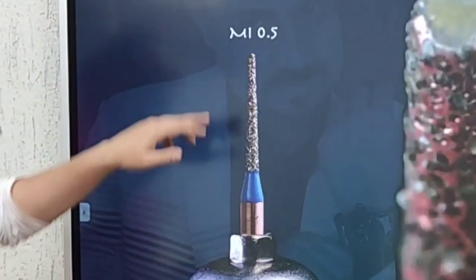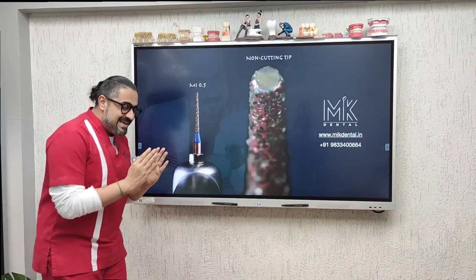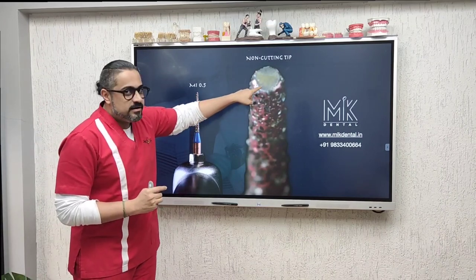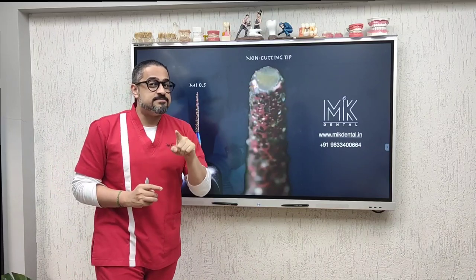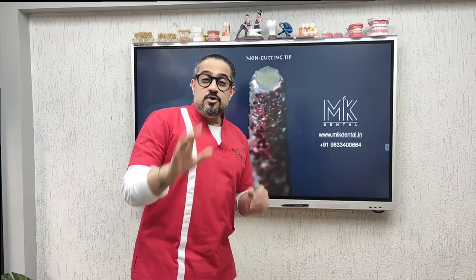To prevent this, friends, I have taken the next step and designed something called the MI 0.5. This is a modified interdental burr — it's a thin taper burr. Look here: it has a non-cutting tip, which means there are no diamonds at the tip. The advantage of this is that if I start at the buccal at a specific level and go through the contact, I will not be able to go any lower because there is no diamond at the tip. This protects the papilla, making sure there is no inflammation, no food lodgment later, and no bleeding.